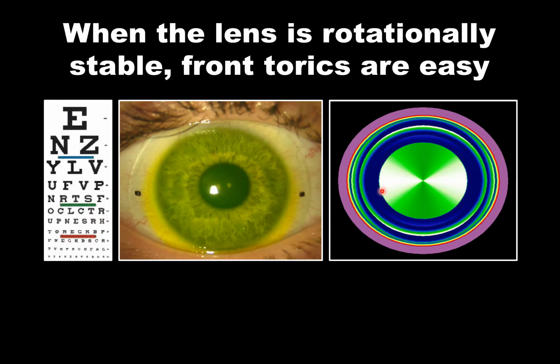So this creates more efficiency in our scleral lens practices because we're going to put a toric landing diagnostic lens on our patient. If they require spherical optics through the lens, then we don't need to do any kind of advanced calculation. However, when we do have residual astigmatism, we don't have to go to a completely different diagnostic lens.